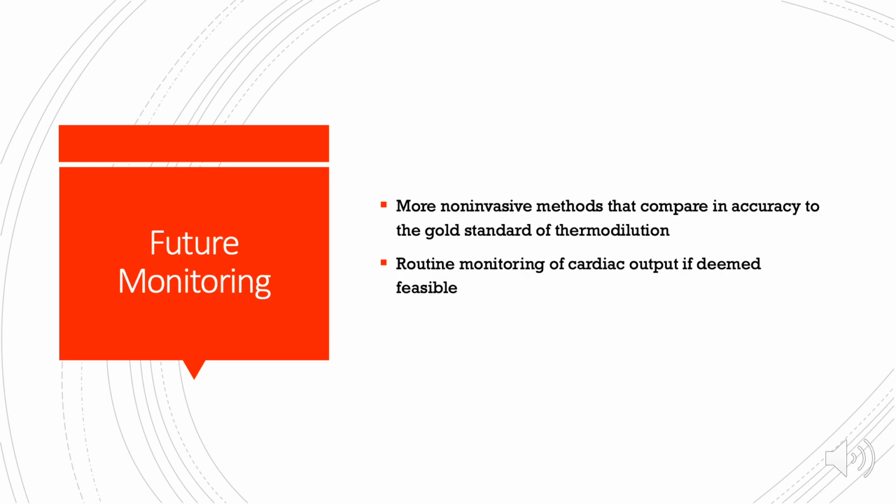For future monitoring, there needs to continue to be work on non-invasive monitoring methods that compare in accuracy to the gold standard. I don't think these methods are being used routinely, and I think if better methods are found, we're able to use them more routinely on people and maybe direct our therapies a little bit better.